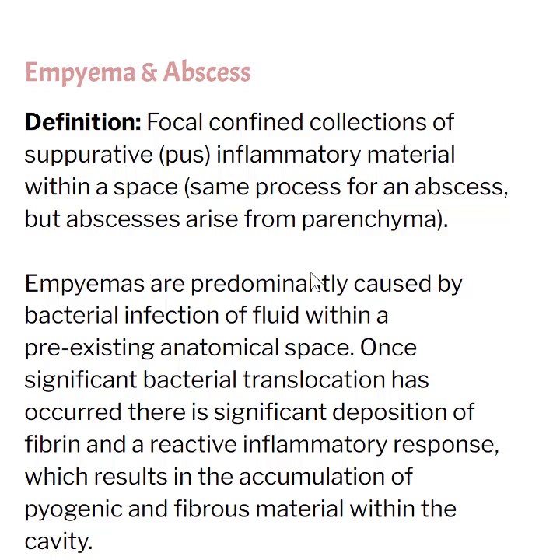What we basically need to look for is anywhere there can be fluid within the peritoneum, an abscess can form. So we want to make sure that we're looking in the subdiaphragmatic space. We want to look all the way through all the quadrants, looking for any phlegmonous changes. We're going to see echogenic fat, stranding layers of phlegmon through there, or we're going to see these walled off circular structures with thick walls and debris within.